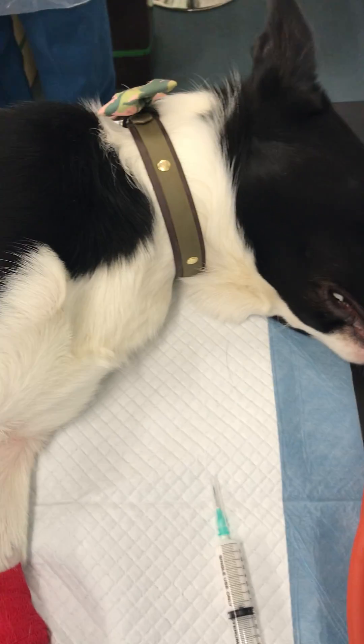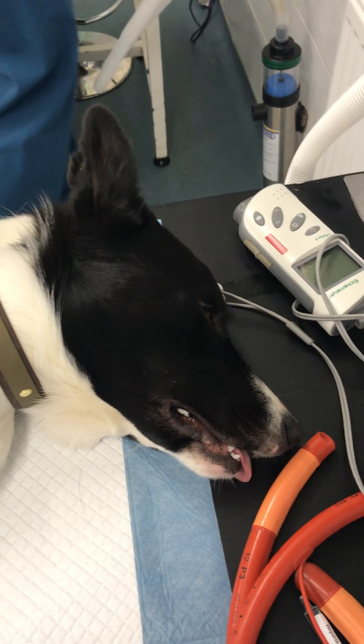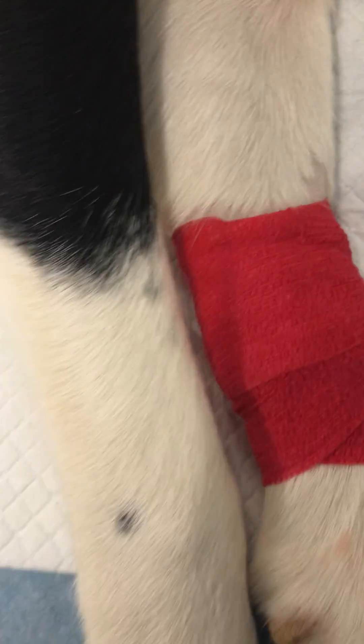Here's a dog that we are going to induce into anaesthesia. It's had its pre-med so it's quite sleepy. We're going to put our cannula in.